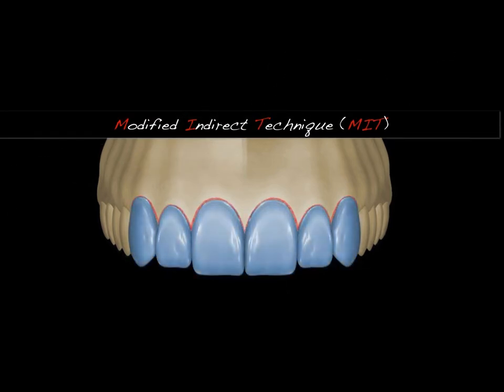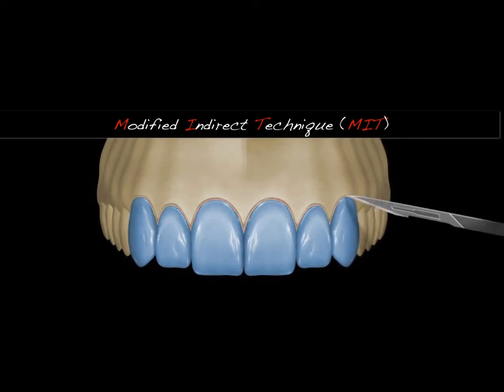In this case, we have the cervical third of this restoration that is longer but even larger, for the reason I said before. It means that the first part of the cervical area is convex, so automatically it will be not just longer but also larger. At this point, we use an instrument to mark this extended margin.